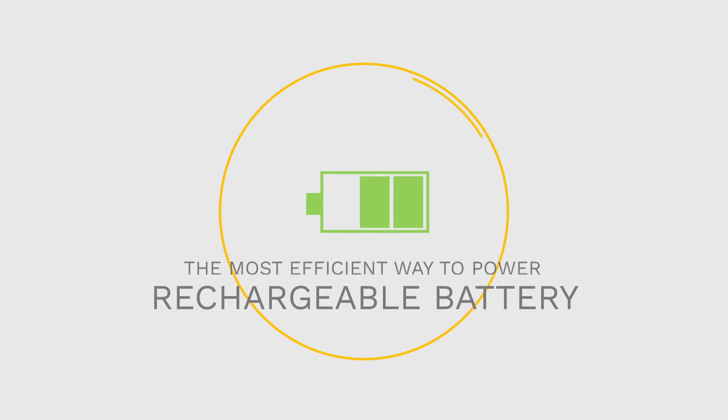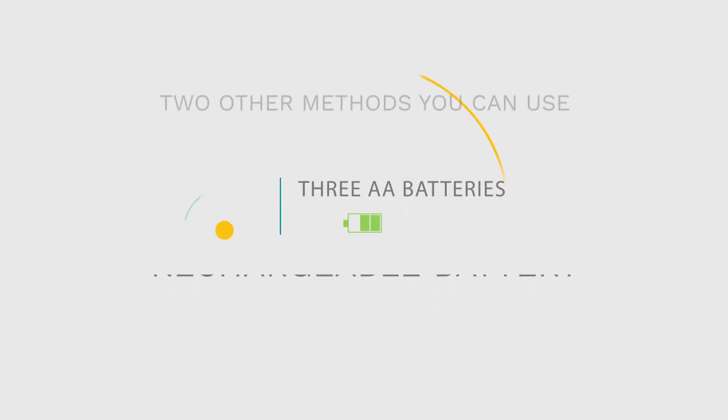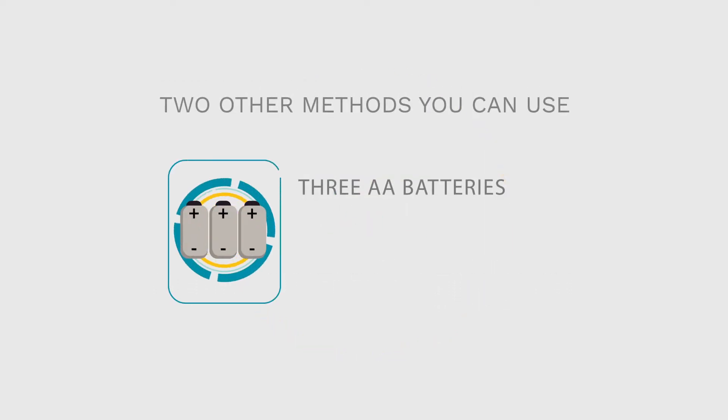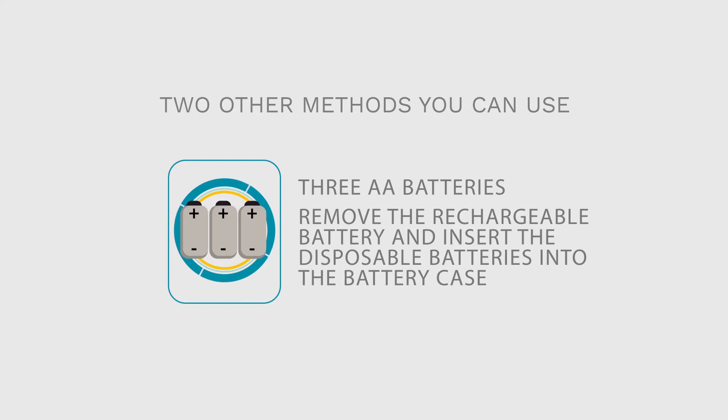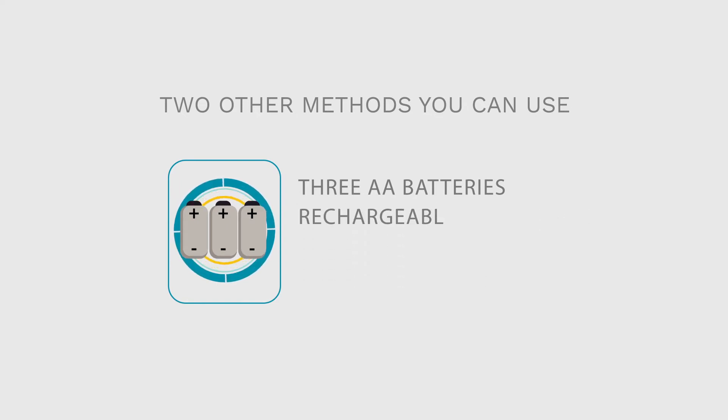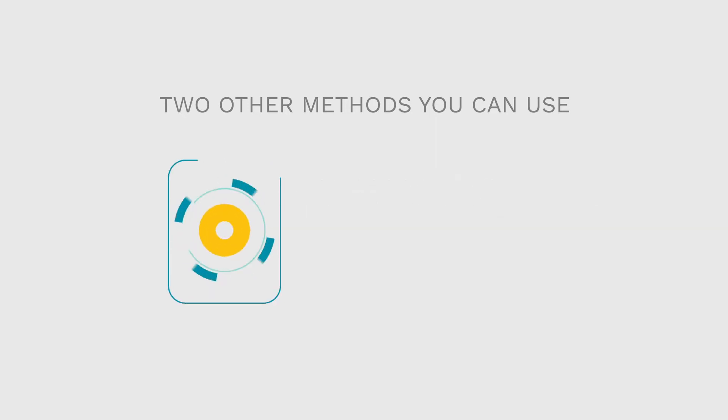The rechargeable battery is the most efficient way to power your oximeter, but if you have an emergency, don't forget that there are two other methods you can use. Three normal alkaline size AA batteries. Remove the rechargeable battery and insert the disposable batteries into the battery case. Just make sure that the plus and minus points are facing the right direction. You can use rechargeable AA batteries in the same way.